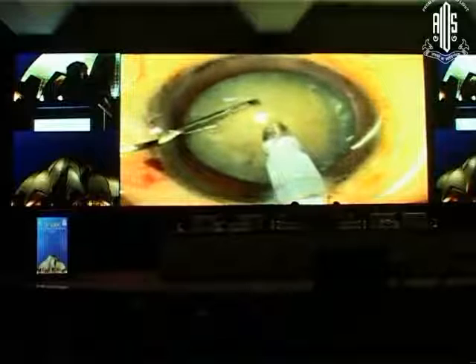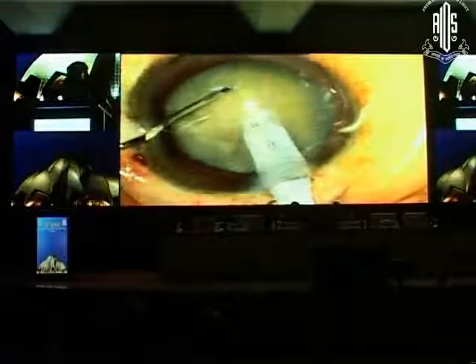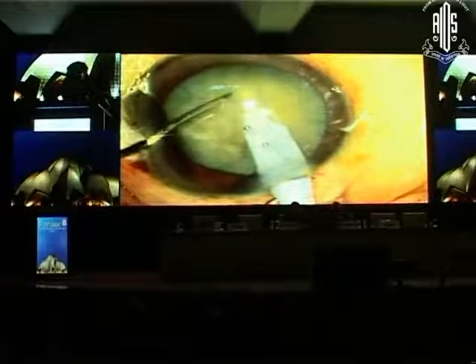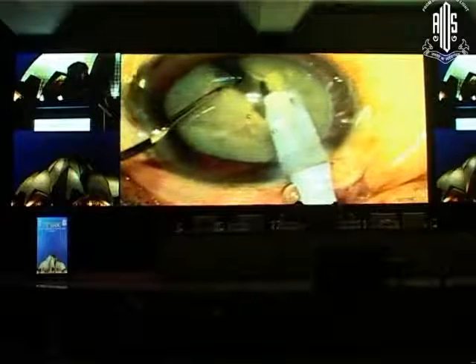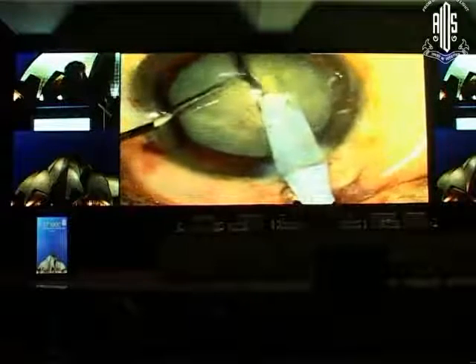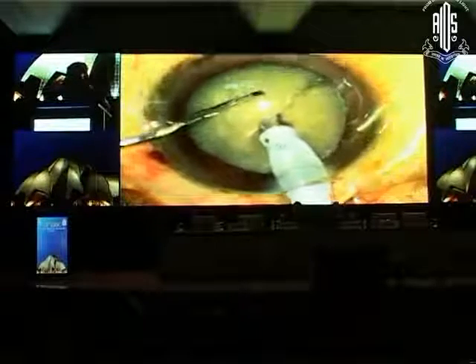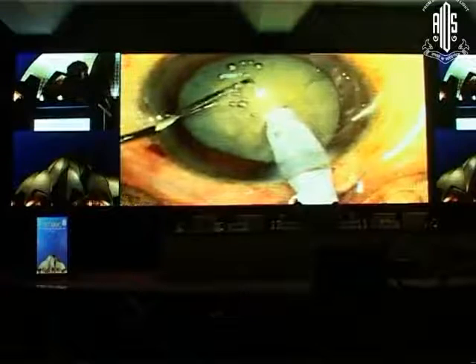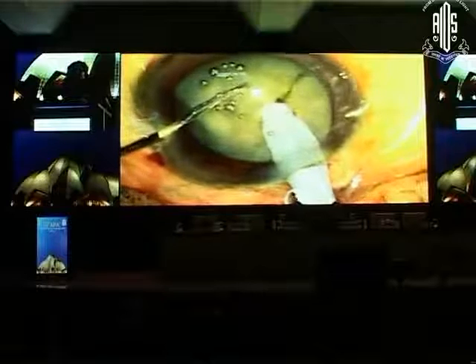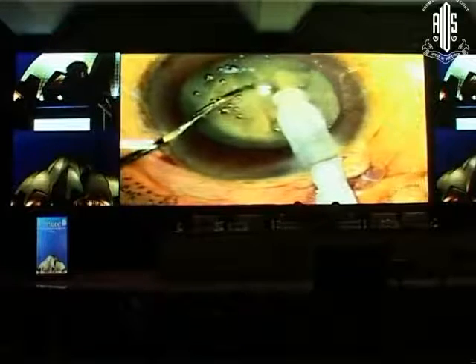So as you can see, watch carefully that the nucleus is embedded, some part of phacoemulsification is done, and you can see the tip advancing slightly. When you embed the tip at the site, phacoemulsification is done so that it remains embedded into that part of the nucleus, and then it is chopped. But just remaining superficially and touching the nucleus without phacoemulsification will cause the nucleus to slip.